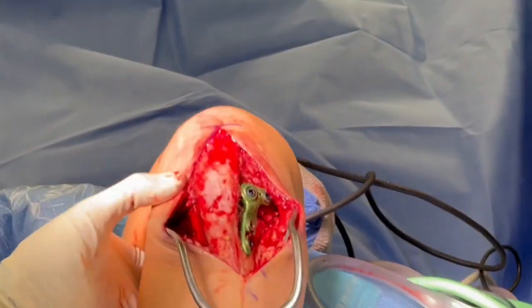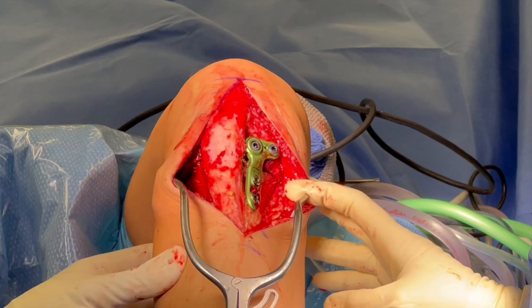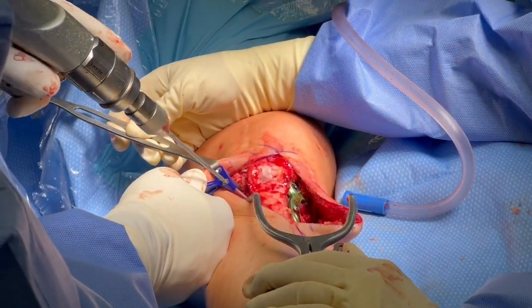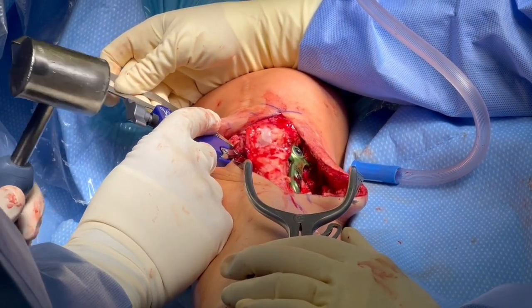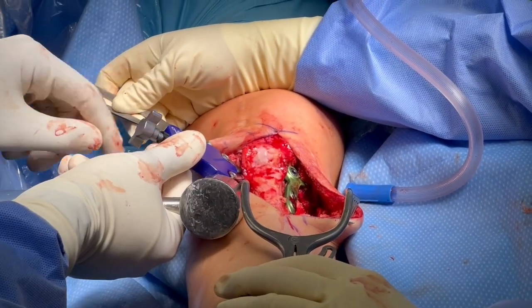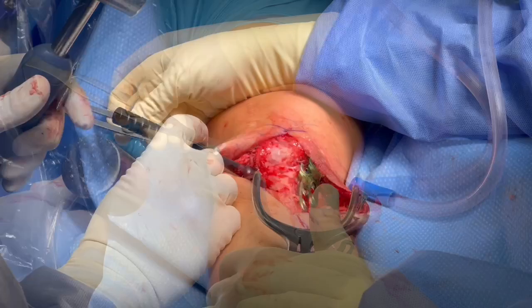We already have excellent fixation. There's no gapping from 0 to 90 degrees, and you can see we've closed down the osteotomy well. For backup on the lateral side, which we've taken off the lateral compartment to see, we're going to place compression staples. These are about 18 and 20 millimeters. This is further backup, and will be out of the way if we do a revision situation — we can keep these in if we want.